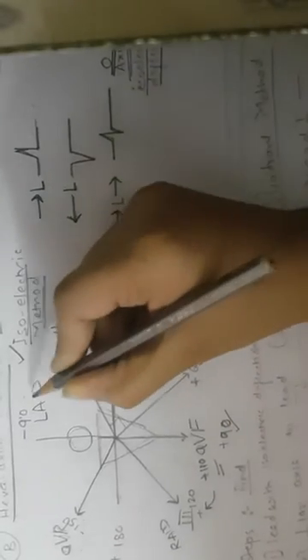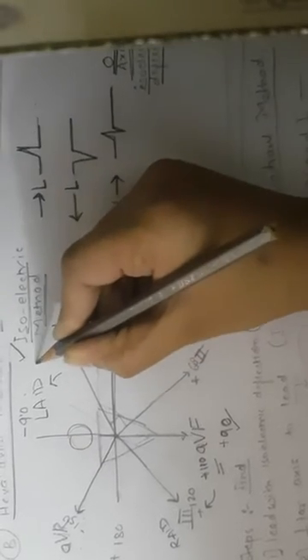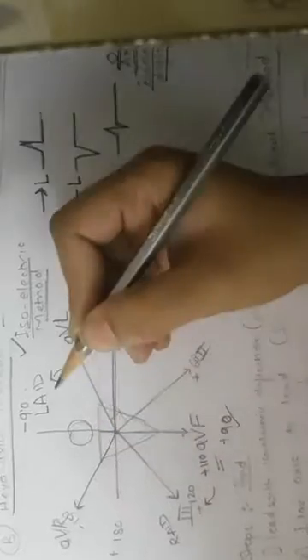When it is moving away on the right side, more than 110 degrees, we call it right axis deviation. If it is moving in this direction, away on the left side in the anti-clockwise direction, we call it left axis deviation, and when it is falling in this quadrant we call it extreme axis deviation.